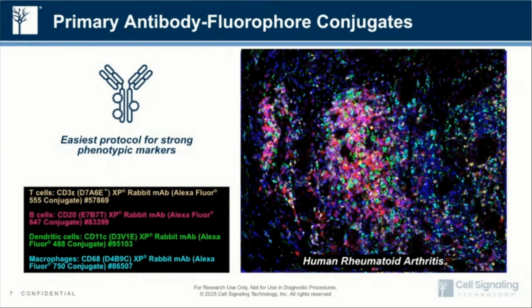Because there's only a handful of fluorophores that can bind to the antibody, it really doesn't enable signal amplification, or sometimes is not able to overcome the background signal that tissues, especially in FFPE, often have. So you can see here, this can be performed in multiplex, really depending on the capability of your microscope to be able to separate the different fluorophores.